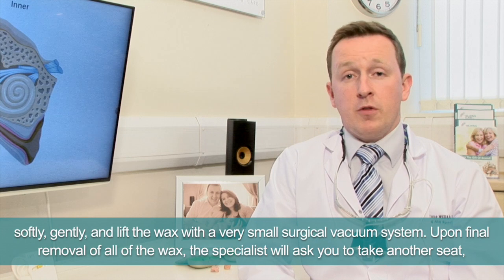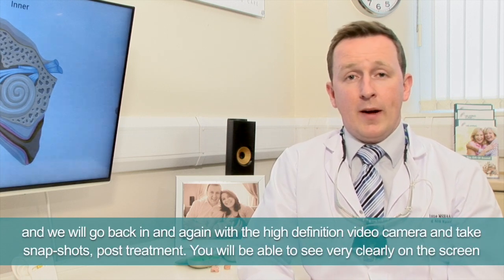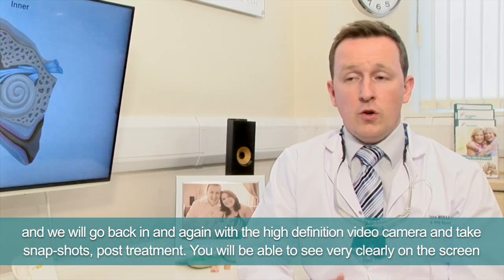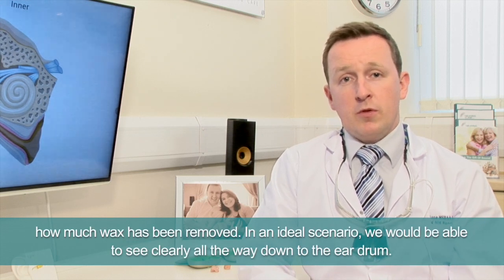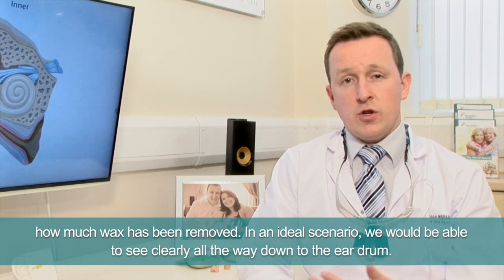Upon final removal of all of the wax, the specialist will ask you to take a seat and we'll go back in again with the high definition video camera to take snapshots post-treatment. You'll be able to see very clearly on the screen how much wax has been removed, and in an ideal scenario we'll be able to see clearly all the way down to the eardrum.